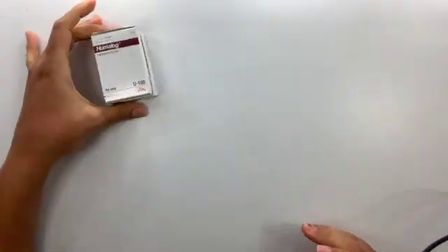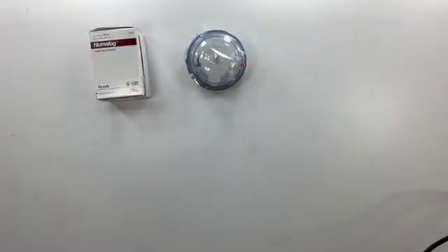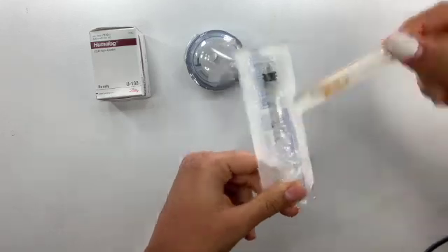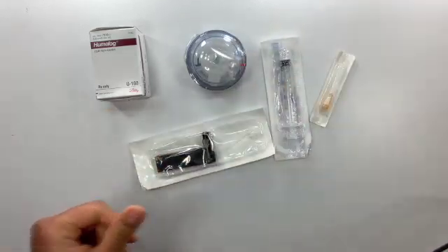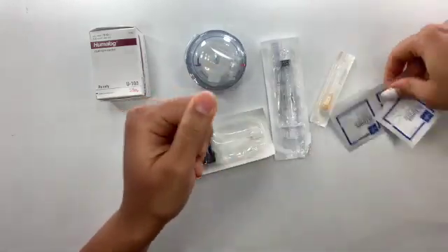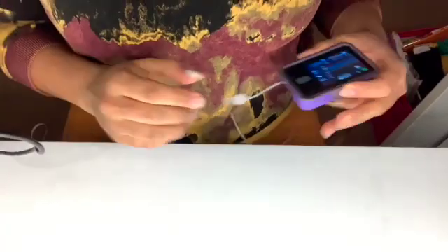Hi guys, so I'm going to start off by showing you what you're going to need. First off, you're going to need your insulin. I use Humalog. And then you're going to need your inset, your syringe, and then the needle. And then you're going to need your cartridge. And last but not least, you're going to need some alcohol swabs. So here's a closer look at everything.